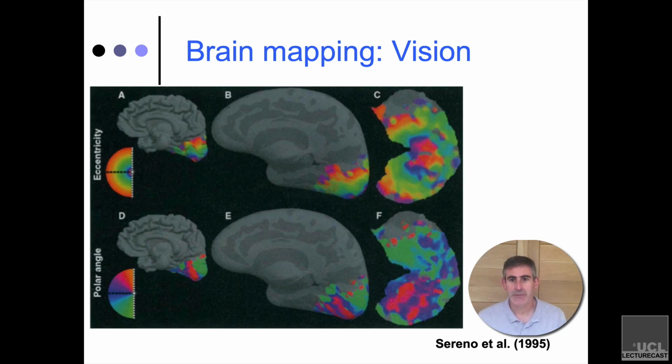So I just want to jump in, because the most common use of fMRI is what we normally refer to as brain mapping. Trying to figure out where in the brain is active when somebody's performing a particular task. And there are good and bad examples of this. One of the really lovely examples was some work that Marty Sereno did in 1995.